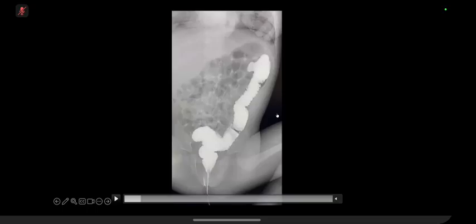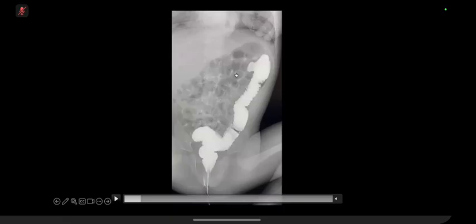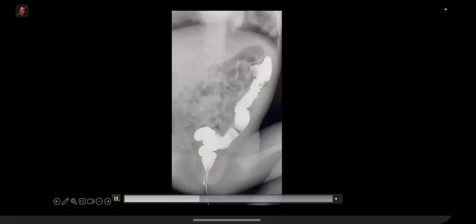Okay, so I told you on the ultrasound images, I actually showed you that there was a segment of bowel which was telescoping at the level of the splenic flexure. So this is the claw sign of the intussusception. And if you follow it up, we are trying to reduce it. So you have to tell me clearly, is it reduced or not?